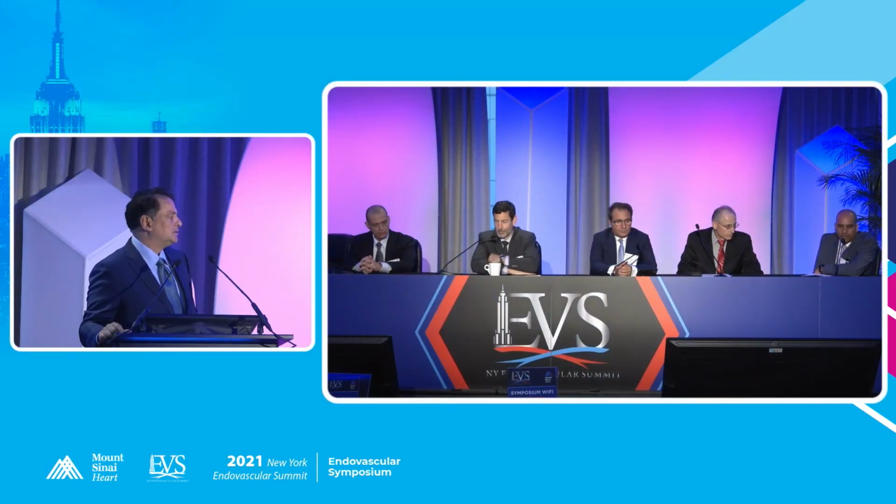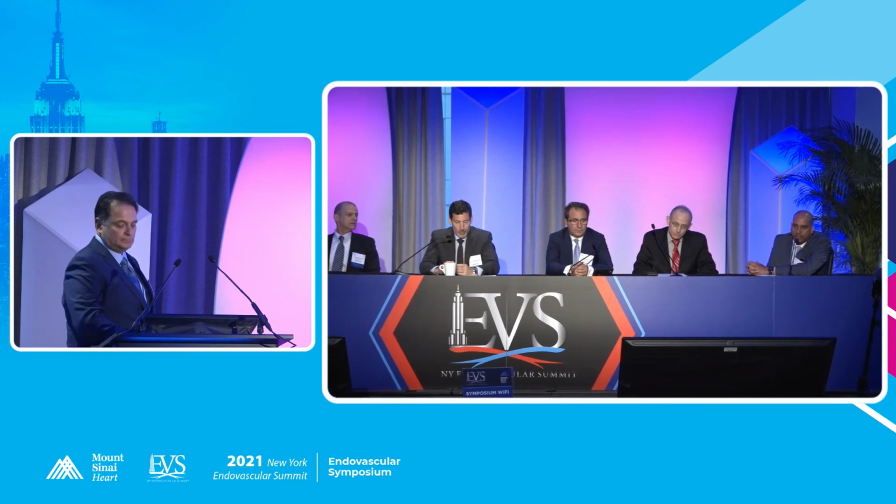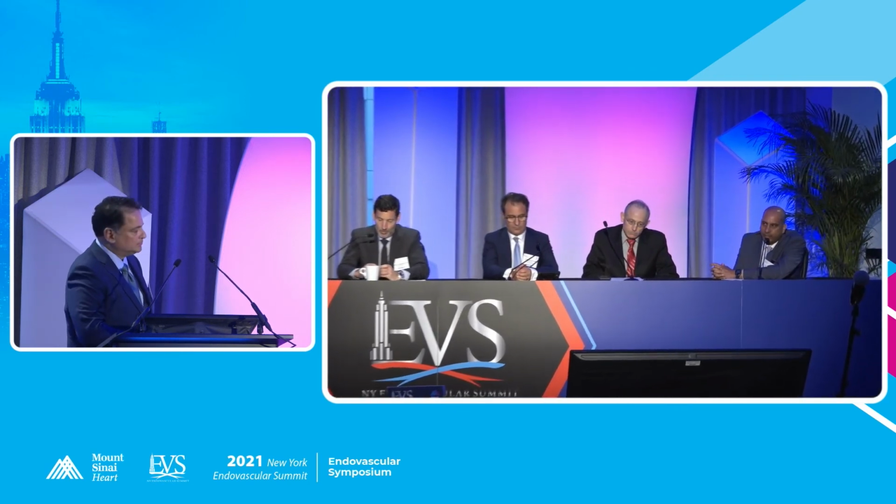Yeah, I think the data is a little bit better on the Eluvia with the head-to-head, but Zilver is not a bad option. I don't think there's a hard, fast, data-driven rule that says you have to use Eluvia over Zilver. At least that's my opinion. So I think you take your choice on which one you like better. I tend to use Eluvia, but that's me. I'd love to hear what the other people have to say about it.